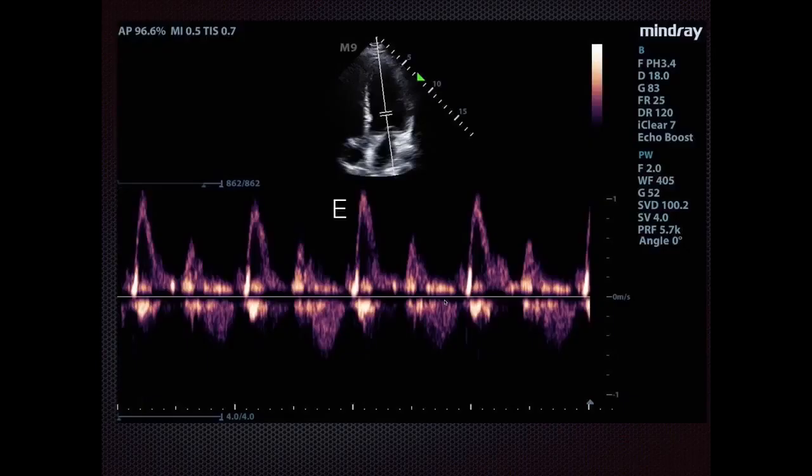So this explains why early in diastole you get this rapid early diastolic filling, so you get that large E wave, and later in diastole you get the smaller A wave with the last 20% as given by the atrial kick. So what I've shown you here is really the normal waveform where E is greater than A. Now let's talk a little bit about diastolic dysfunction.